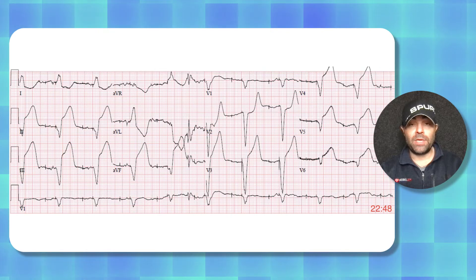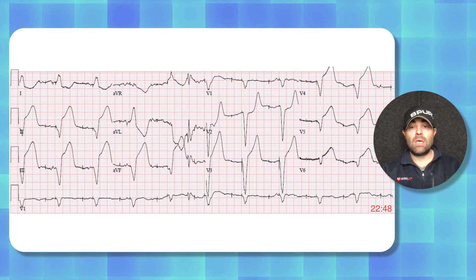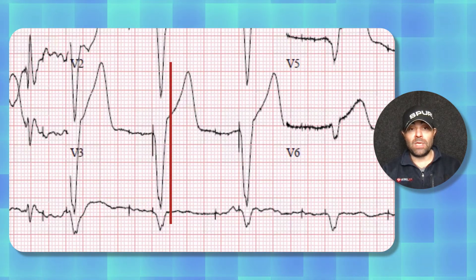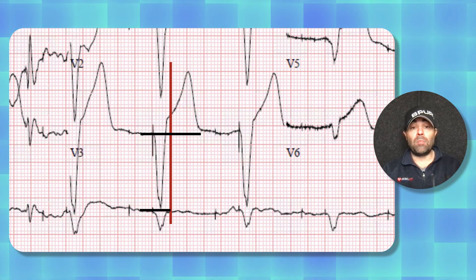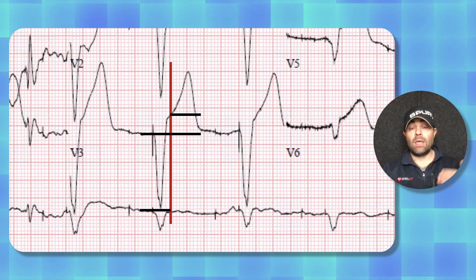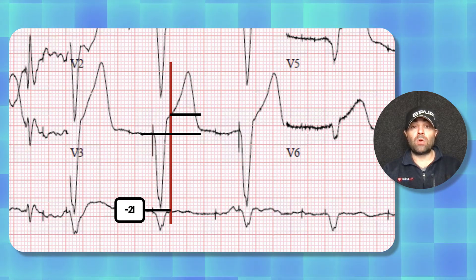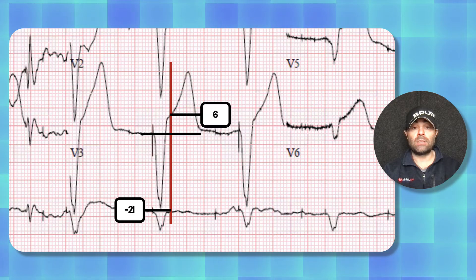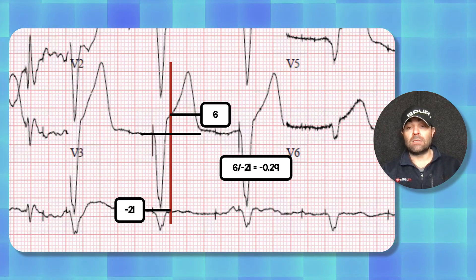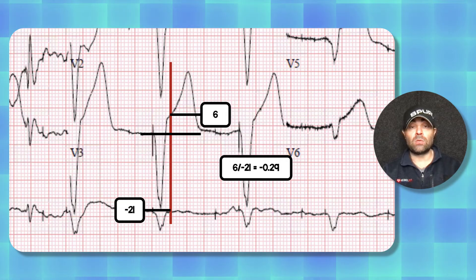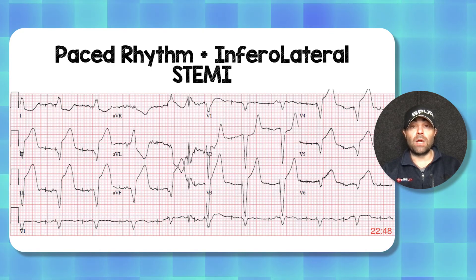Here's another patient presenting with chest pain and shortness of breath. Again, there's no concordant change in any of the leads. Looking at the leads with the biggest amplitude, the red line is the J point and the black line is the baseline. Counting the boxes gives negative 21 for the QRS amplitude and six for the ST elevation at the J point. Dividing these gives negative 0.29, which is 29% — greater than 25%. This ended up being a paced rhythm with an infralateral occlusion myocardial infarction.